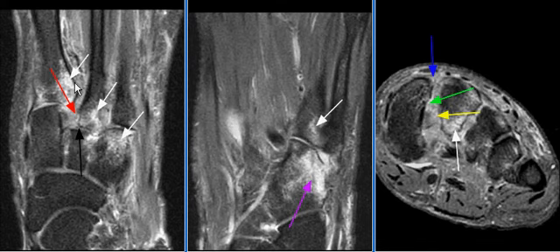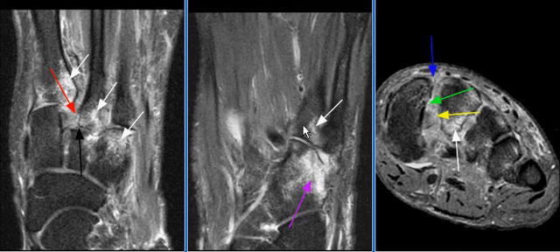There is lateral offset of the first, second, and third metatarsal bone bases with respect to the medial, intermediate, and lateral cuneiform bones, respectively.